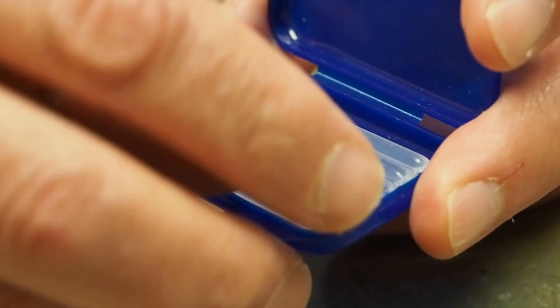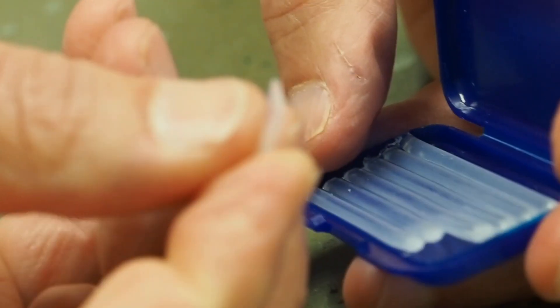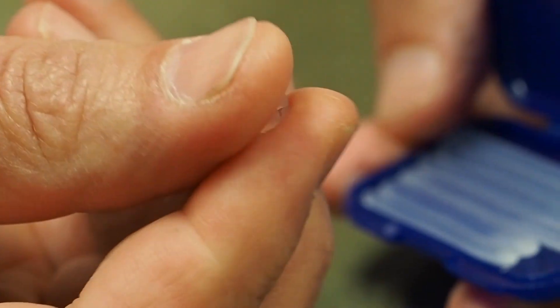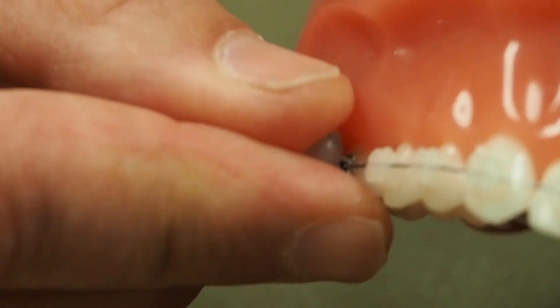Another tool for cheek irritation is wax. Usually to get wax to stick effectively, you have to soften it a little bit. So roll it between your fingers, and then find whatever it is that's causing you the pain, and gently push the wax right on top of that piece of the braces.